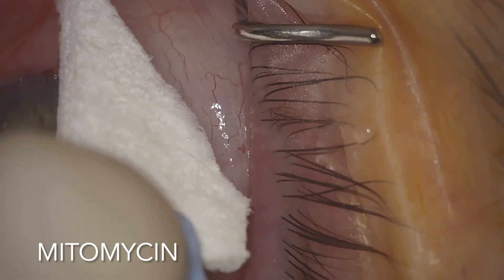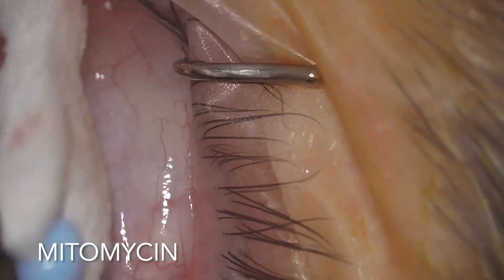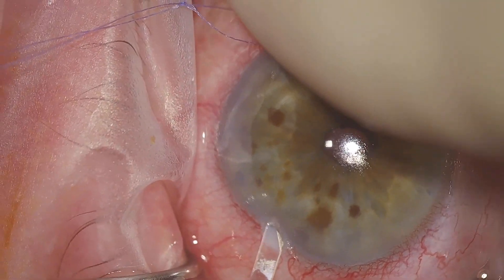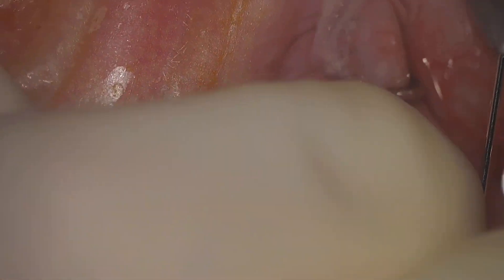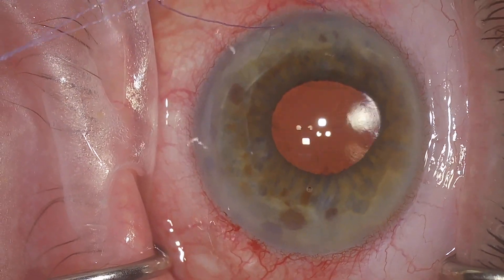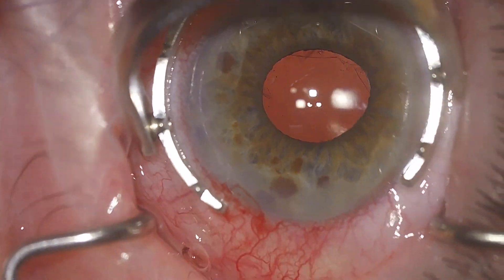The mitomycin is being placed subconjunctivally — this is about 40 micrograms of mitomycin on a patient who's been on three glaucoma drops for about 10 years. This patient also has a history of chronic angle closure glaucoma that was initially treated with cataract removal, ECP laser, and peripheral iridotomy. He did quite well with a mixed mechanism glaucoma for several years. He underwent a Kahook dual blade goniotomy approximately six months ago and really didn't restore the drainage canal as much as I'd hoped, so the next step is proceeding to his Xen to help improve his intraocular pressure control.